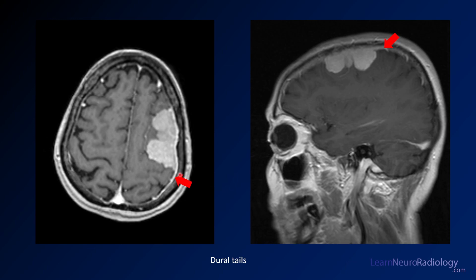Here are the post-contrast images. You see this avidly enhancing, pretty homogeneous mass with a broad dural attachment. There's a dural tail where you can see the cellular components of the tumor extending along the dura — that's one of the quintessential findings of meningioma. If you're looking at an extra-axial mass that's homogeneous and avidly enhancing, meningioma is really your top one, two, and three on the differential.